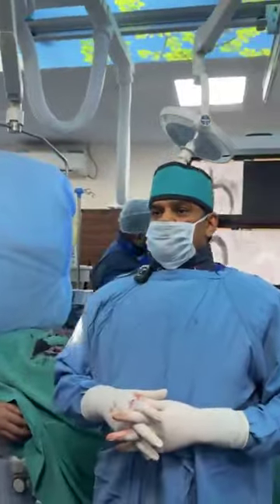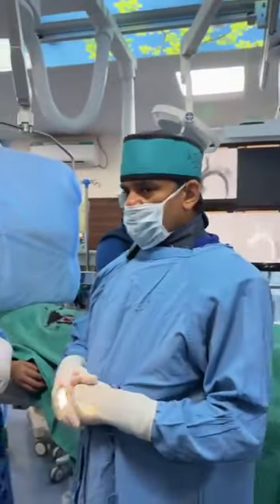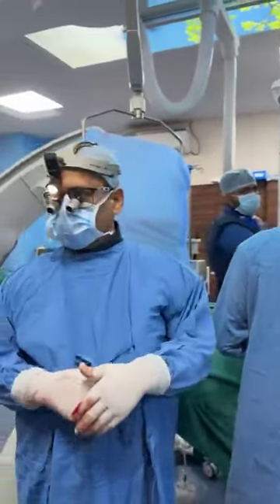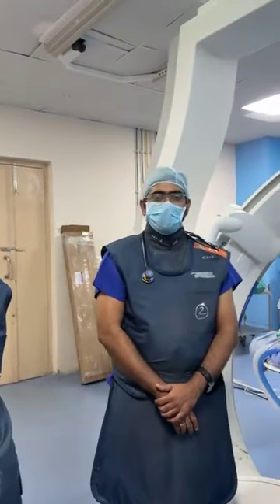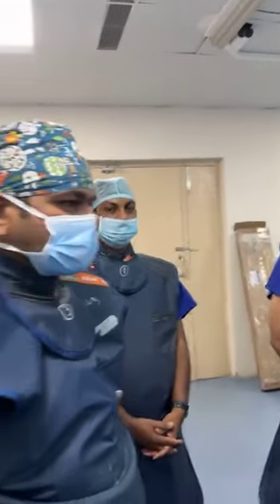Good. I think we are coming to the end of the procedure. So this is beautifully done. So we are thankful to God for this wonderful opportunity. And all our team members: Dr. Bipul, our cardiac surgeon; Dr. Prashant, cardiac anesthetist; Shiv Shankar; our sister Surya. Why so much contrast?